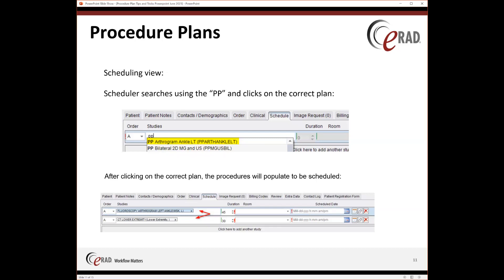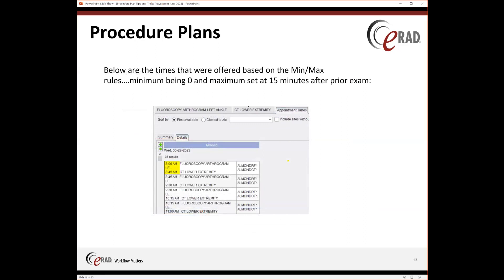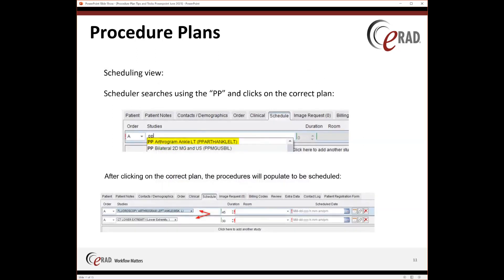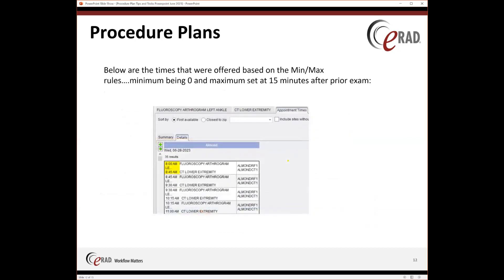So you have both your fluoroscopy and your CT. Below are the times that were offered based on the minimum and maximum rules — minimum being zero and the maximum being 15 minutes after the prior exam. If you recall, the fluoroscopy is a 45-minute duration. So it's giving fluoroscopy at 8 o'clock and the CT at 8:45. But technically, with a maximum set at 15 minutes after, these exams could have been set for 8 and 9 o'clock as well.